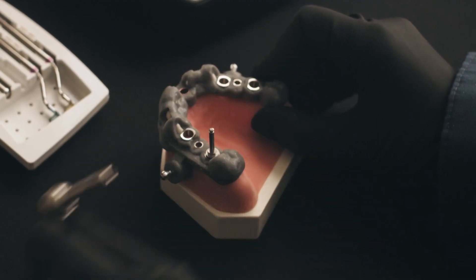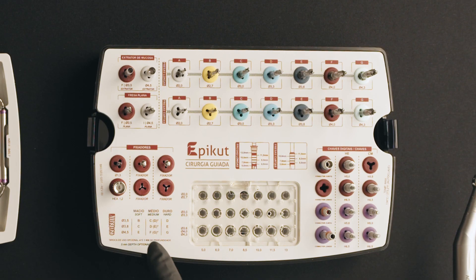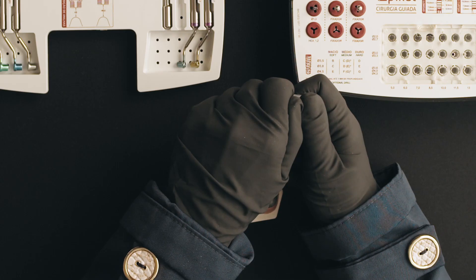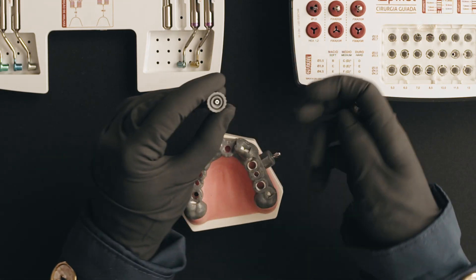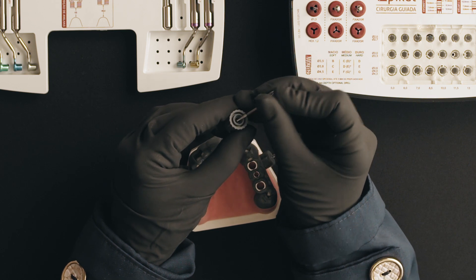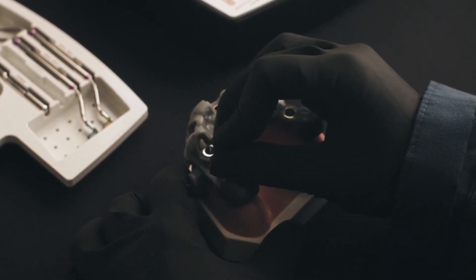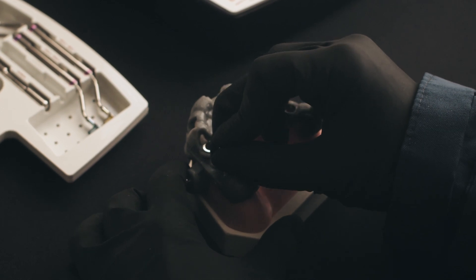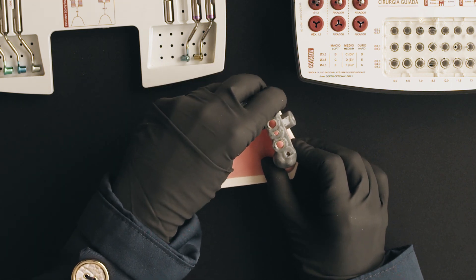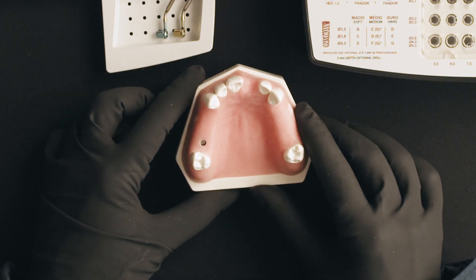Remove all elements. With the 1.2 millimeters hex wrench included in the kit, remove the cover screw from the blister cap. Then remove the fixation pins, remove the guide, and the implant placement is concluded.